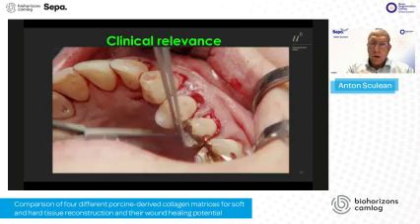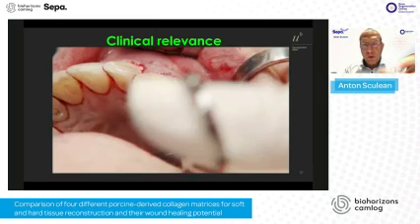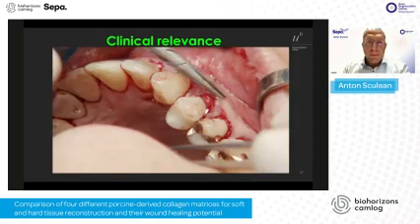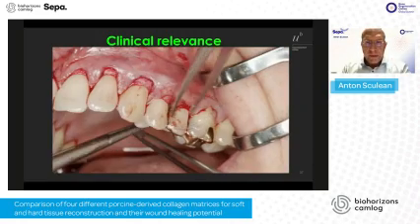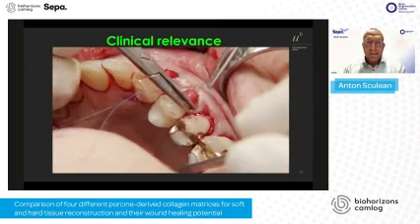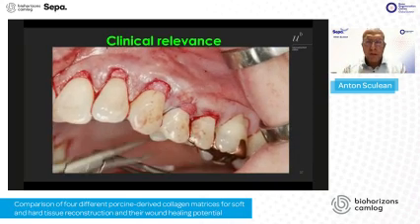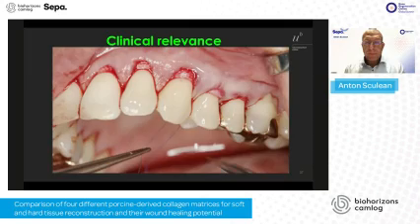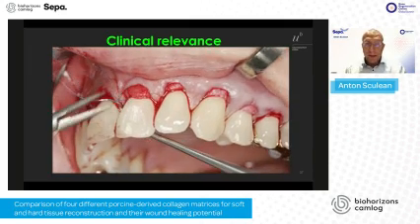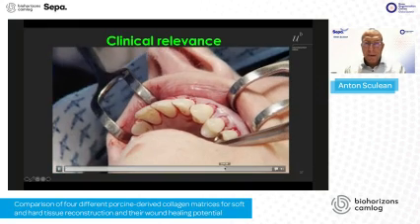And if you look now at the bleeding, you can observe that the material absorbs the blood from the surrounding tissue. And what do we have in the blood? We have growth factors, obviously. So we have the growth factors, and we know from our studies that these growth factors are going to be kept in the wound, and they are going to be released over a period of roughly 2 weeks or even longer.